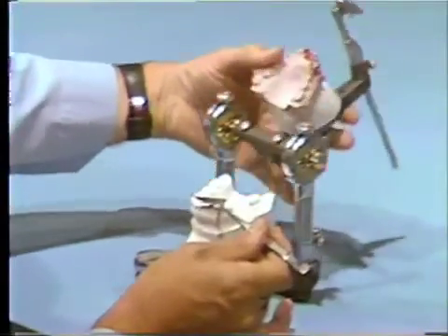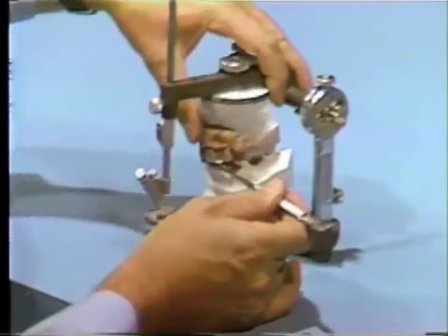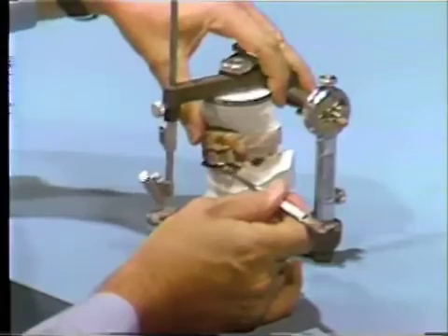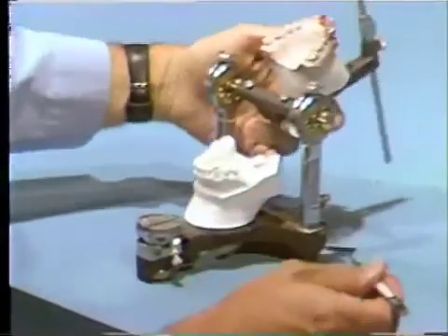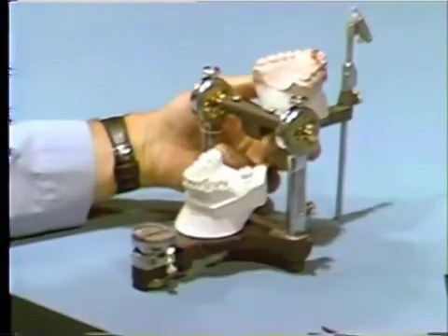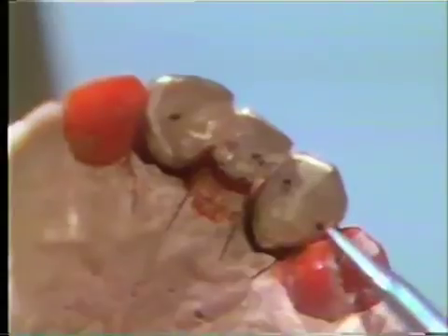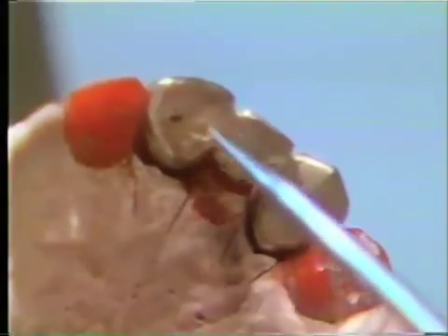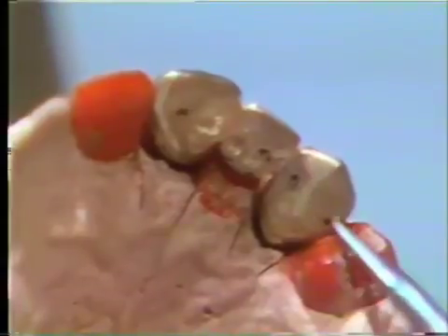The bridge is then tried back on the model and the occlusion is checked with shim stock and articulating paper. You should see the centric stop areas. If these are not correct, it is adjusted at this time until the occlusion is correct.